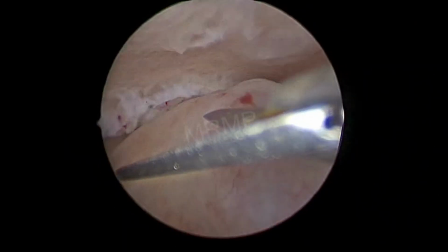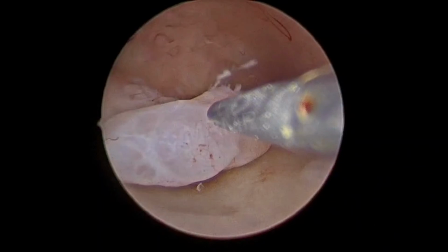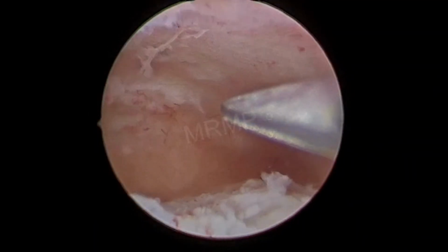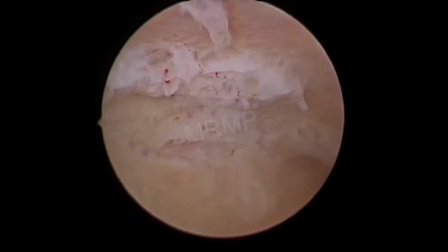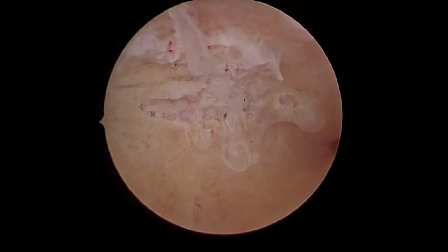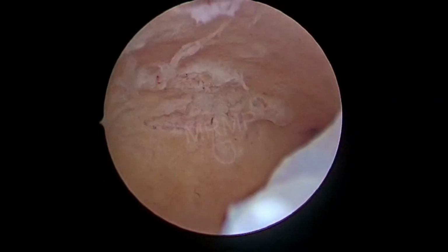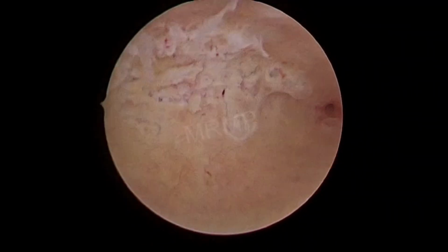Now the polyp is detached completely and the remaining polyp stalk may be recut, and this is the small bleeder as you noticed, which will settle automatically. Then the removal by the ovum forceps. The cavity is re-examined and both the ostia should be looked for.